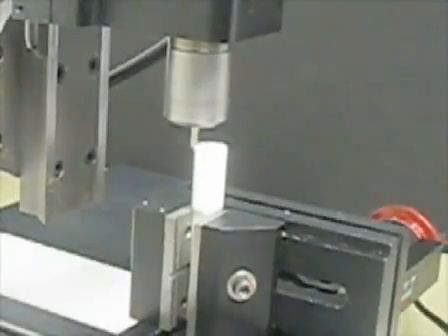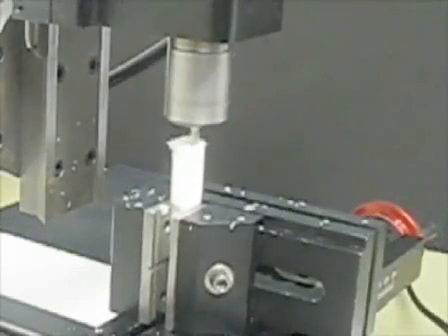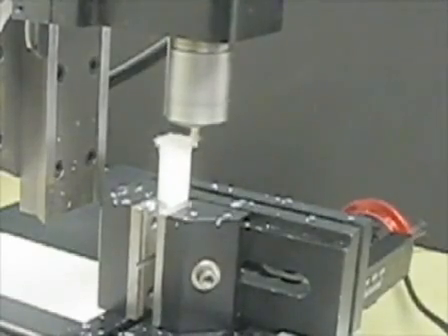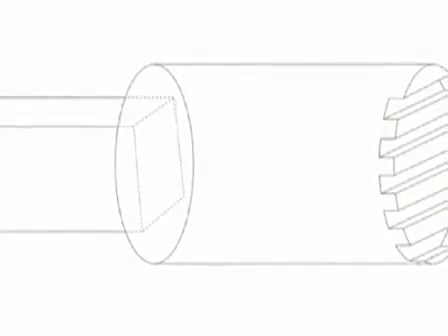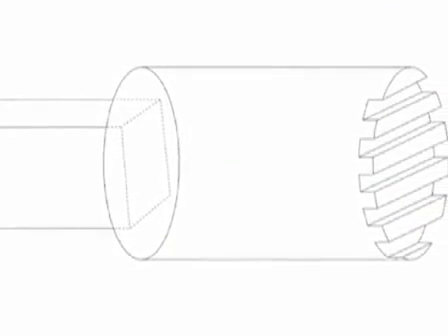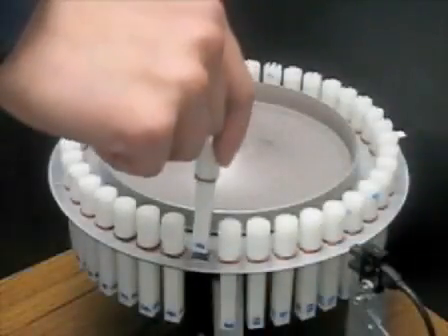We cut parallel grooves into the round face to create square wave gratings with equal groove and ridge widths. To cut larger grooves, we used an end mill. For smaller grooves, we used slitting saws. We place silicone O-rings around the shaft to reduce vibration of pieces as the disc spins.